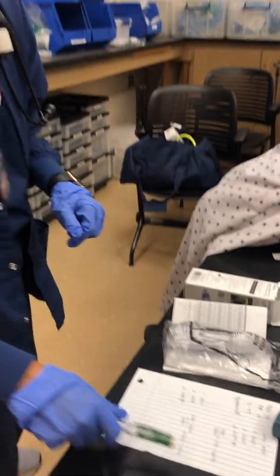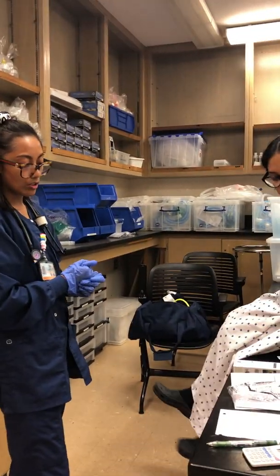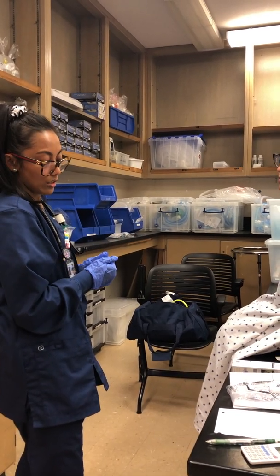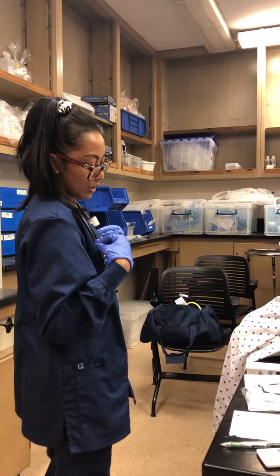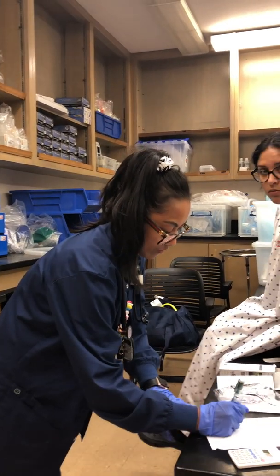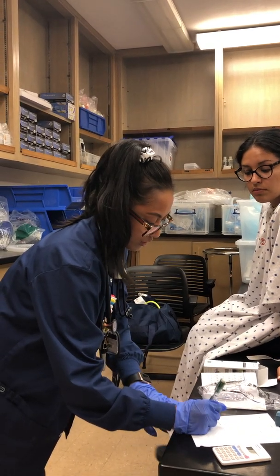This means that the medication of the albuterol helped with the meter dose inhaler. As long as there's between a 15 to 20% improvement, then that means that the medication works. So we're gonna continue with this. And then I'm also gonna do your vitals, just to make sure that everything is okay. I'm gonna do your pulse, your respiration, and your O2.